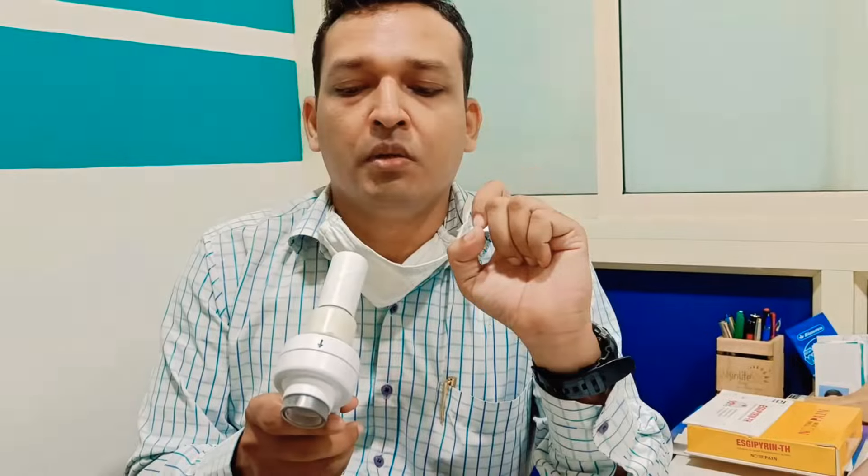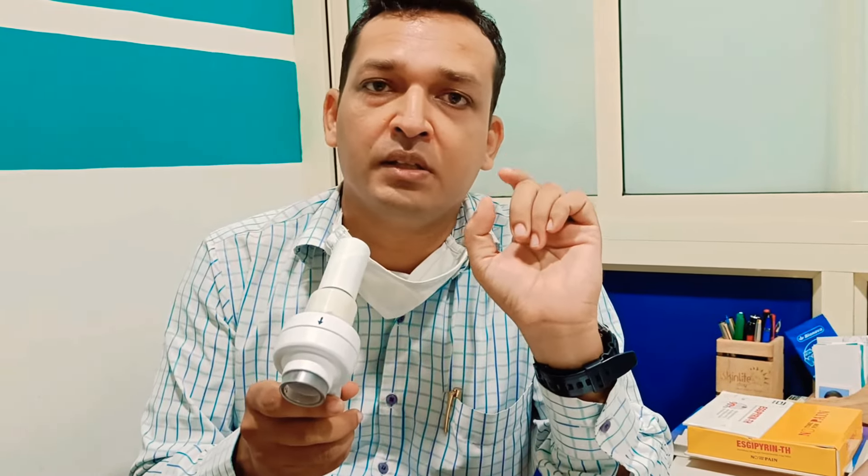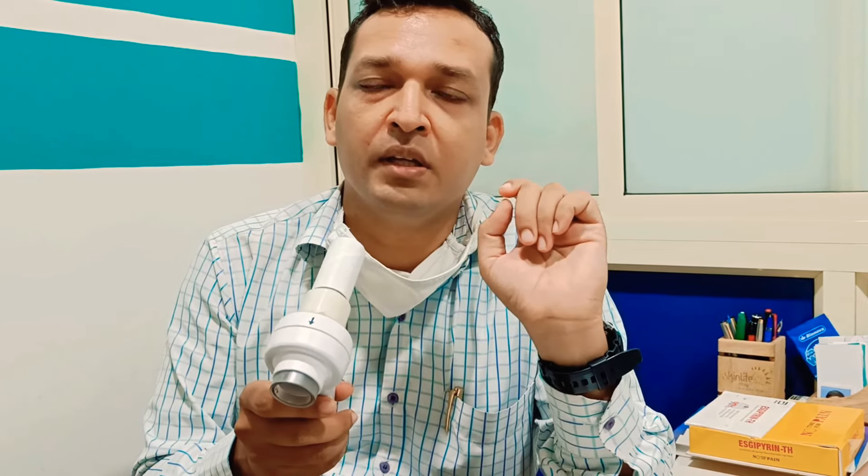Whenever you perform the test, you have to blow correctly through the machine.